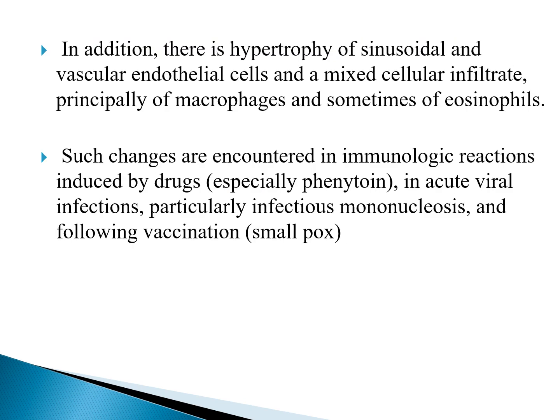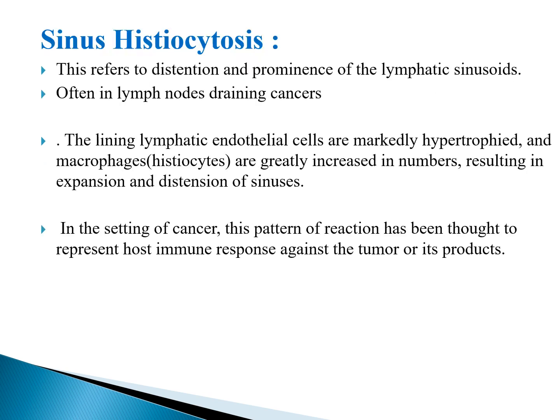In addition, there is hypertrophy of the sinusoidal and vascular endothelial cells and a mixed cellular infiltrate, principally of macrophages and sometimes eosinophils. Such changes are encountered in immunologic reactions induced by drugs, especially phenytoin, in acute viral infections, particularly infectious mononucleosis, and following vaccination, such as smallpox.